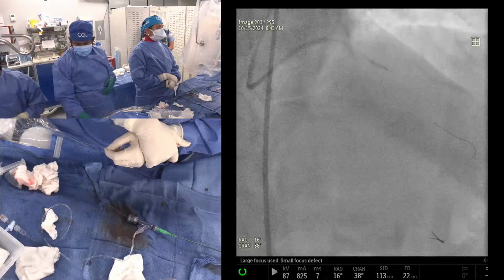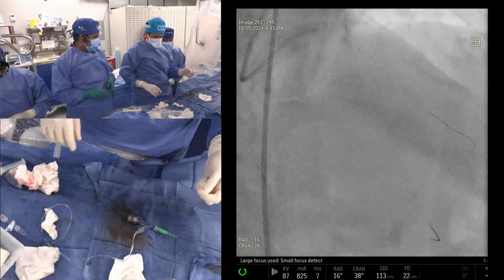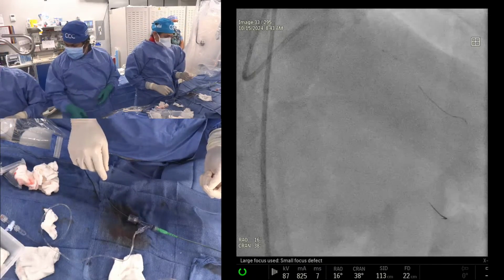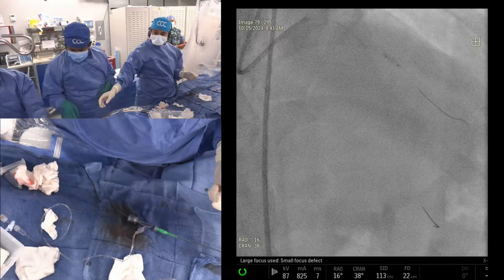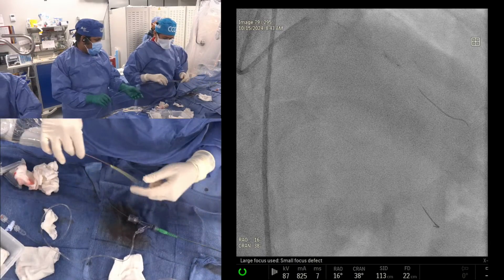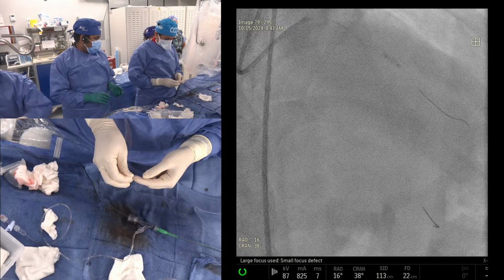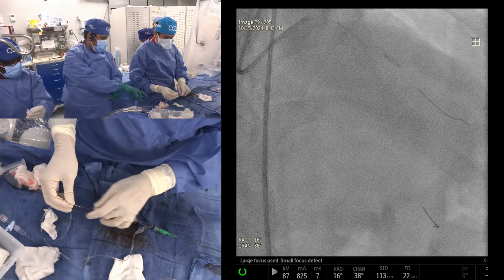This, no, would we be calling it a step crush approach? No, we'll try to see if we can do a mini crush with a 6 French. It'll be an issue then? No, it will go, it will go. The only thing is the 48, because the length may give a little trouble, but let's see. The 6 French, I am a big believer. Even the company, Boston Scientific, can't say that 2 Synergy stents can go through a 6 French, and I showed them the example. Quite a bit.